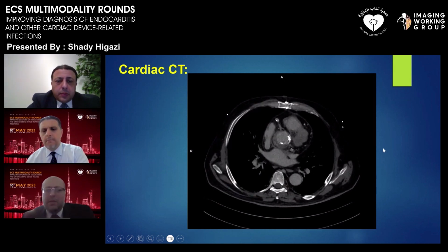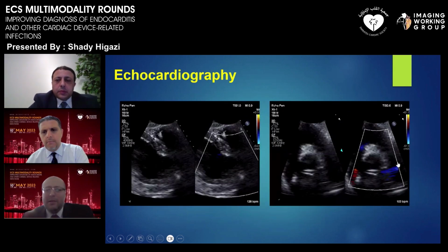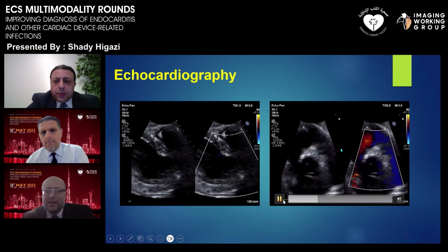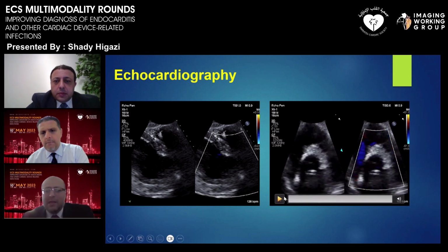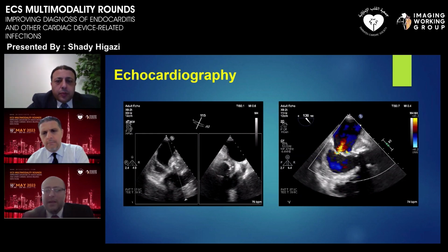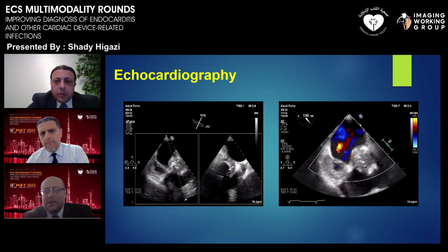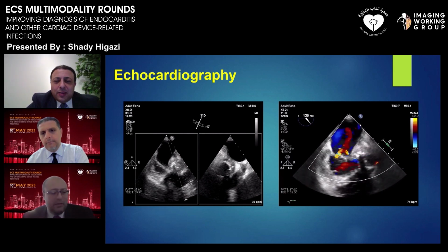To me, I don't think this patient is going to get better. In the echo, as I remember, there was no appreciable AR at this time. Yeah, that's good to know, because the CT looks like it was all protocoled in systole, which is why you have the valve all open, so you don't get a diastolic frame of the aortic valve. But irrespective, I don't think this patient is going to get better. Either he's going to be on maintenance therapy, but this is a patient who is prone to develop significant complications from that.